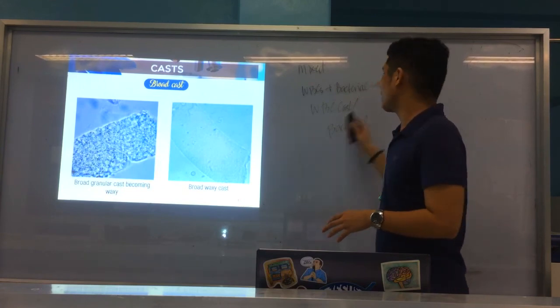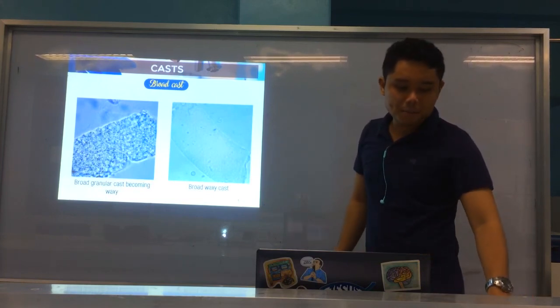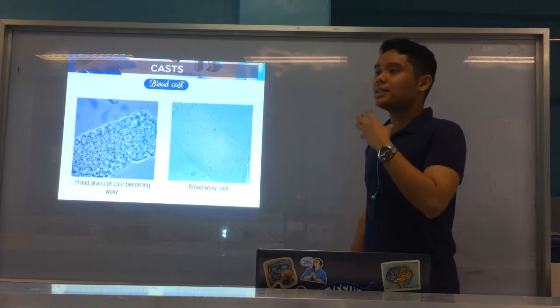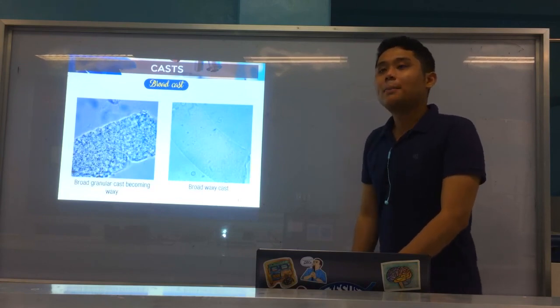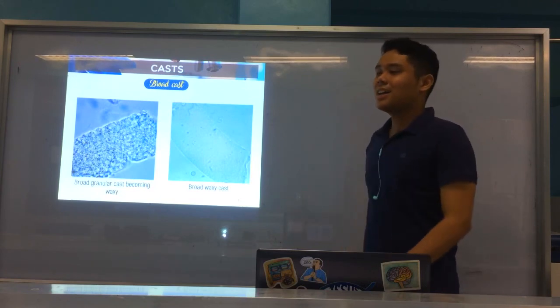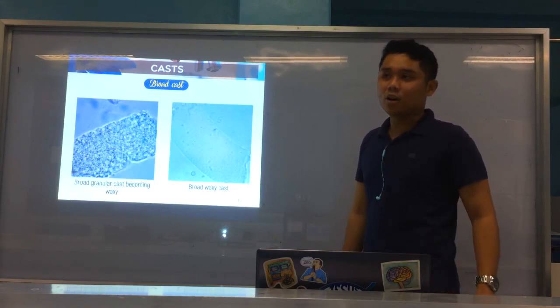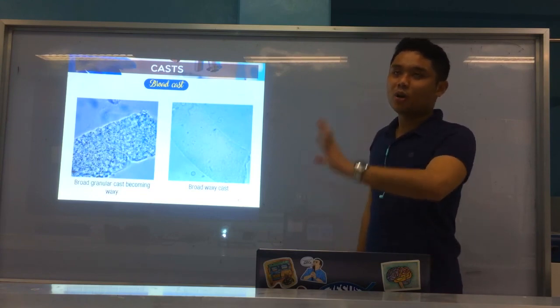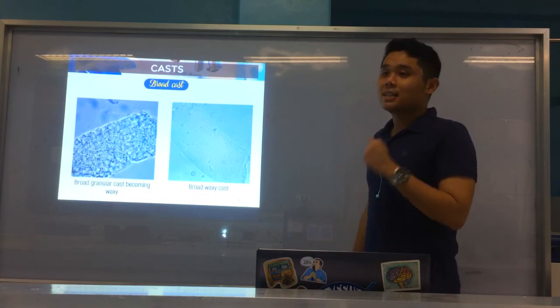I hope the information is clear. Don't forget again this primary distinction between pyelonephritis and cystitis: what urinary finding? The WBC casts. What is the major protein constituent of your casts? Uromodulin or Tamm-Horsfall protein. Where else is uromodulin seen, as what urinary constituent? The mucous threads. And what is the site in your nephron where casts are usually found, or the primary site where the casts are made? The distal convoluted tubule or the collecting duct, but primarily the distal convoluted tubule. The presence of casts in the urine is termed cylindruria.